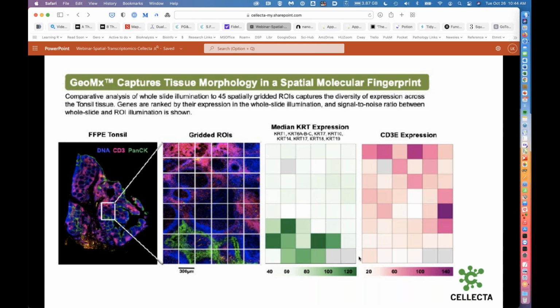This is part of the reason the general practice is for any given query, we collect 3 or 5 different regions of interest that are replicates to pool the data subsequently and to avoid any potential impact from the occasional outlier. And here's another one where there's plenty of CD3 staining, but not much signal once we get to the transcriptome level.